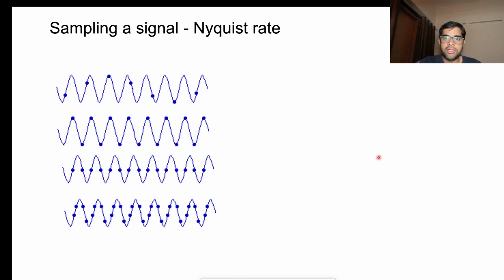Is it clear, Arushi? I'm still confused about whether the same sample that you're looking at has two different frequencies, like you said, one is 1 kilohertz, the other is 80. What if this happens in the same sample, or does it not happen?